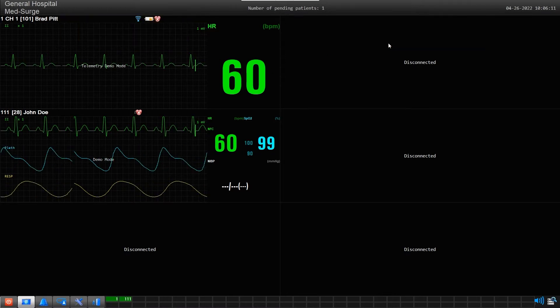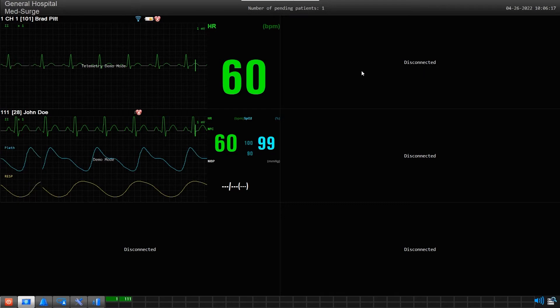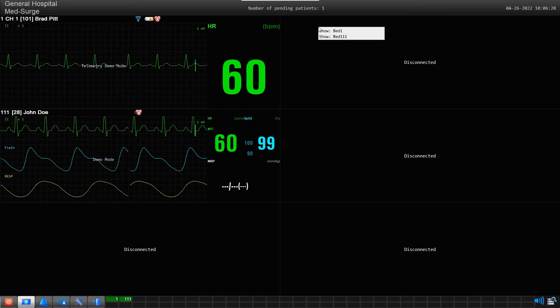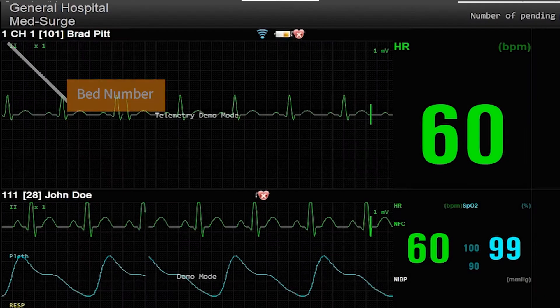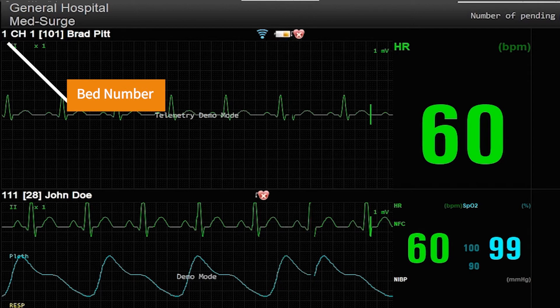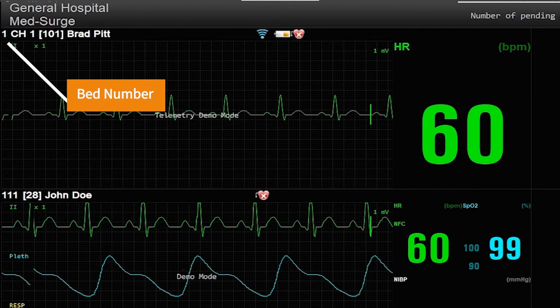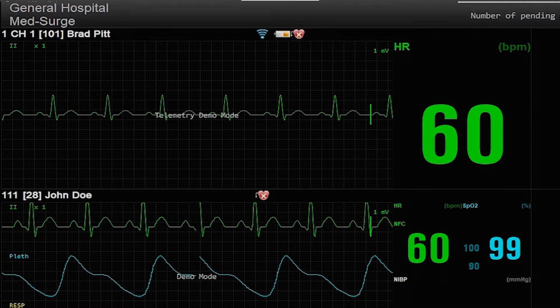First, find a vacant slot on the right you wish to move the patient into, then click in this general area. You will see a drop-down menu appear with a show command of all the currently active admitted patients. Individual patients can be identified by their bed number. The bed number will be the first number in the information header located here.